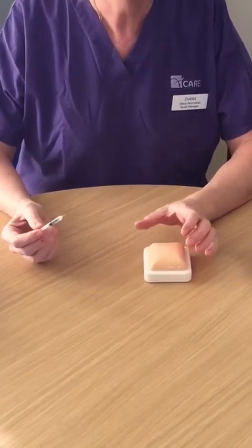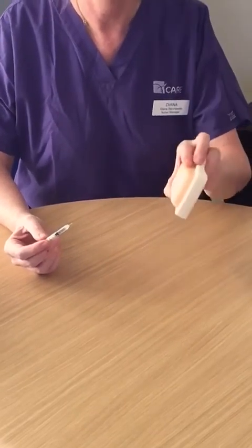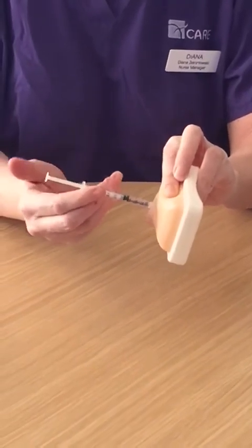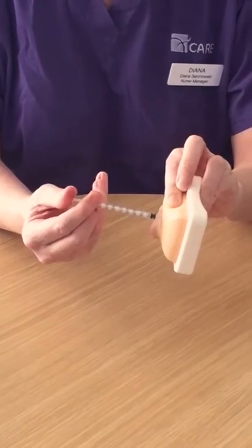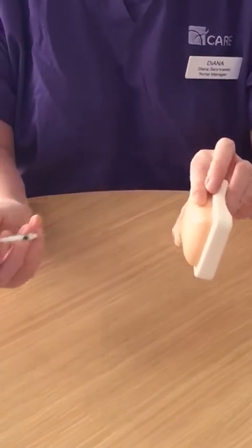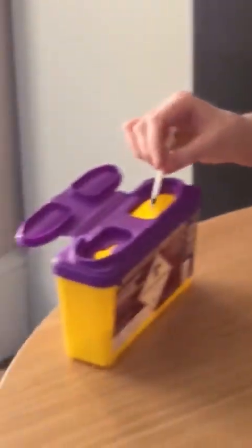Gonal-F is given by subcutaneous injection into the abdomen or thigh. You need to pinch the skin. Insert your needle at 90 degrees and then depress on the plunger. Wait for a few seconds and then remove the needle and release your grip. Place your used syringe into your sharps bin.